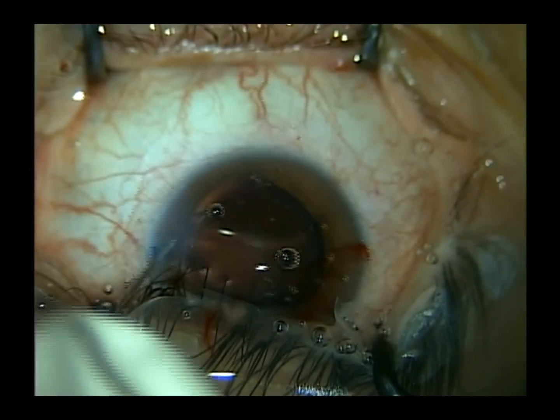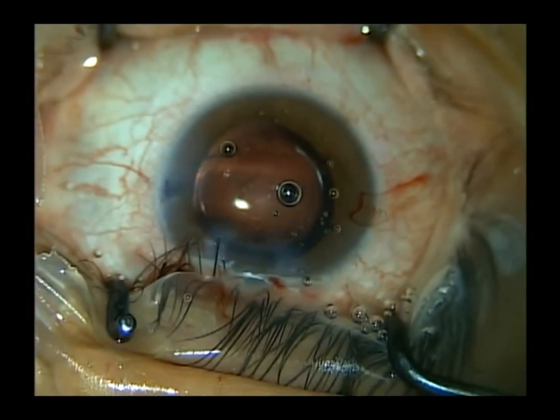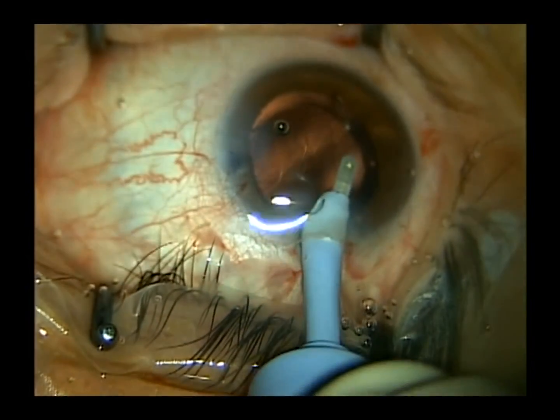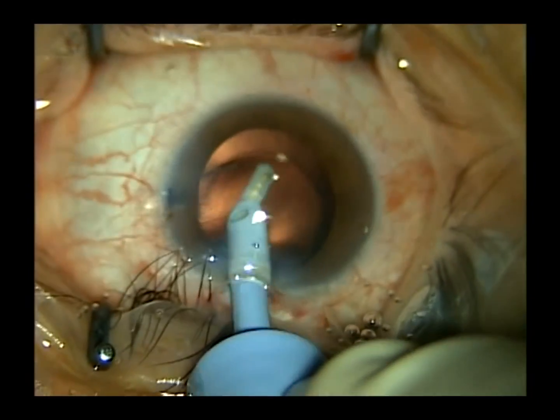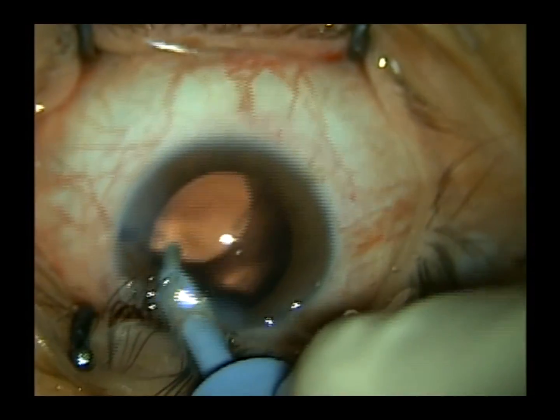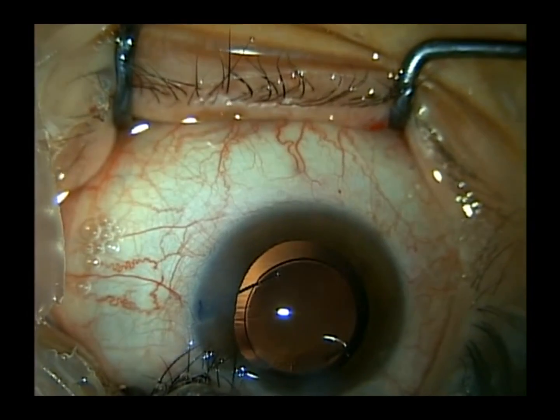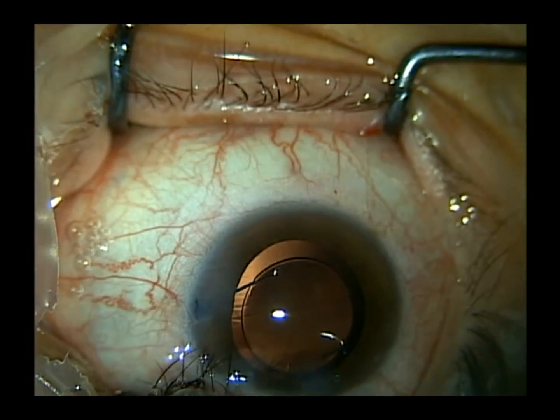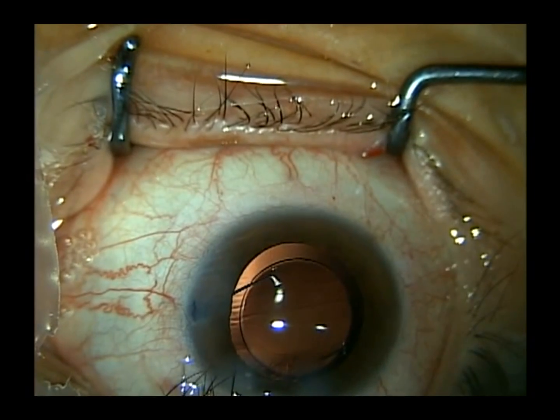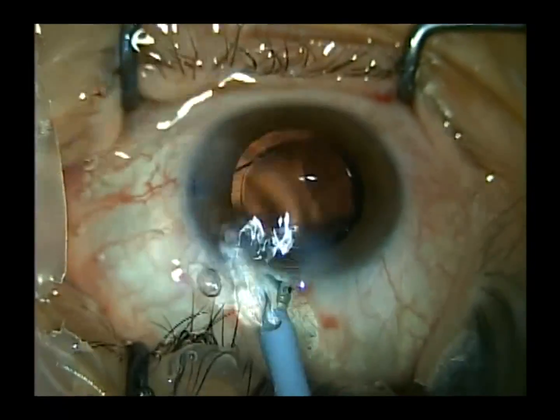I'll usually blow out my paracentesis port before irrigation and aspiration of the viscoelastic, to blow away any cortical fragments which may sequester themselves at the paracentesis port. As I remove the viscoelastic, I like to spin the lens as many revolutions as necessary to free up any residual cortical fragments hiding in the equator of the capsular bag, and to get rid of any residual viscoelastic in front of and behind the IOL.